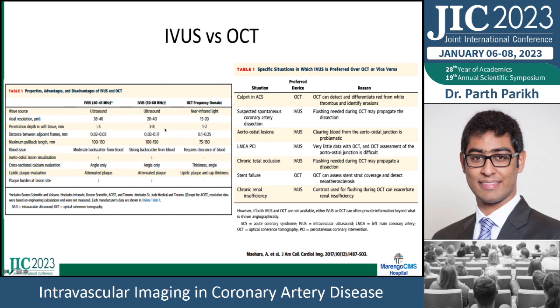One of the biggest differences which I would want to point out is that for OCT, you need to clear out the blood, which is why we use contrast. So in patients who have worsening renal function or CKD not yet on dialysis, advanced kidney disease, you want to kind of stay away from OCT to prevent giving additional contrast, while IVUS does not need contrast.